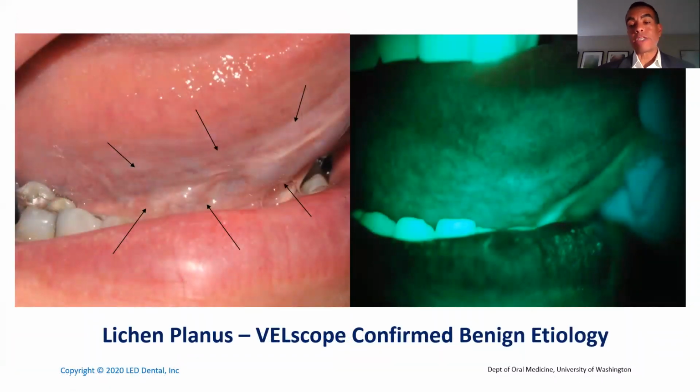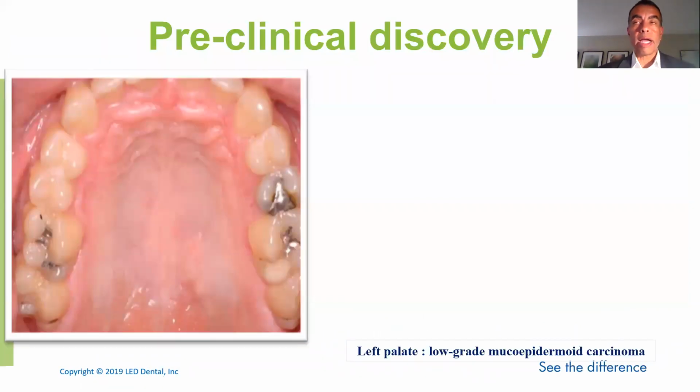Again, a lot of things you're going to see will present themselves as benign. Again, erosive lichen planus, linear lichen planus, or hyperkeratosis. So, a last famous picture. And I think this in itself attests to the challenge that you have as clinicians to screen for this hideous disease. The reason being is, generally, we are not finding these changes until they're closer to the surface.